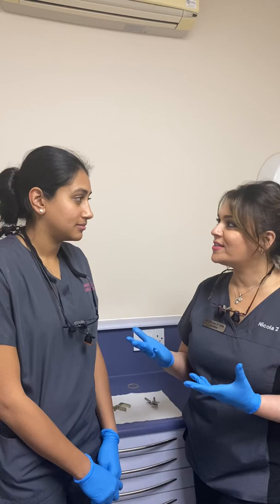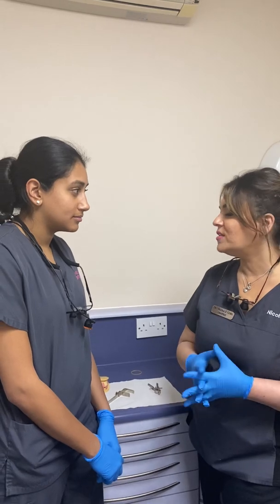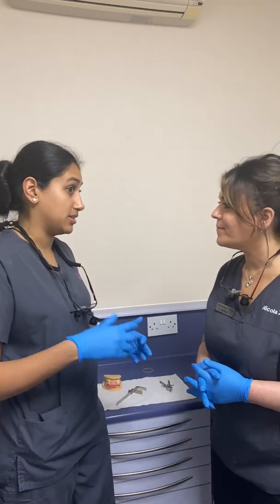Today we have Kavita here and she's going to discuss bite registration. We have a partially dentate patient here, but this would actually be the same for a fully dentate patient. So Kavita, if a patient comes to see you for a new set of dentures, whether partial or full, what are the types of questions you might ask? Well, ask if they really want dentures and if they function without dentures first of all.